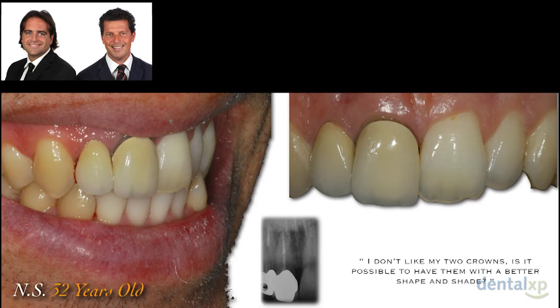We have a gray color in the critical aesthetic interface between the teeth and the gingiva. We have a canting of the dental midline. We have these 2 restorations that are too bulky.